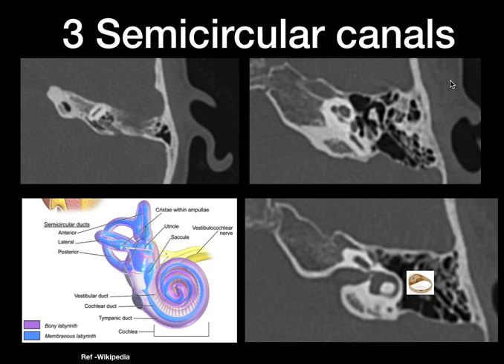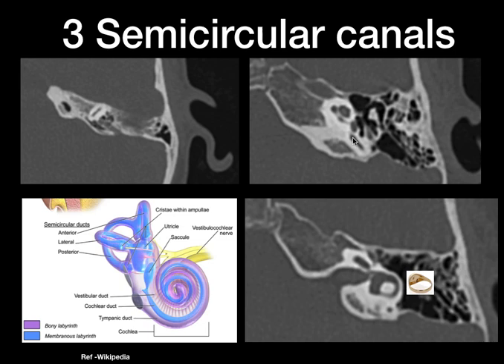Coming to the three semicircular canals — when scrolling through the temporal bone in the axial plane from above, the first structure encountered is the superior semicircular canal. Going down gradually, we get the horizontal or lateral semicircular canal, which gives the signet ring appearance on the axial plane — the ring, the vestibule, and the lateral semicircular canal. Going further down, you can see the posterior semicircular canal. Look for the presence of all three and also for any semicircular canal dehiscence in the coronal plane, which can lead to vertigo and imbalance.